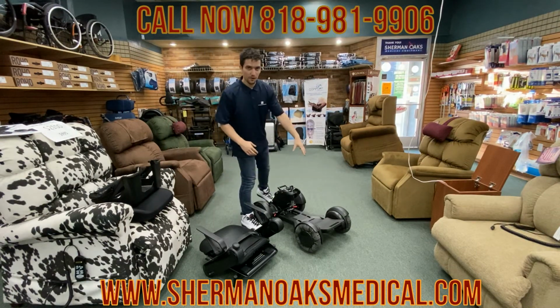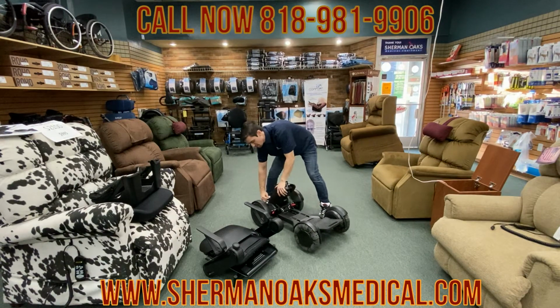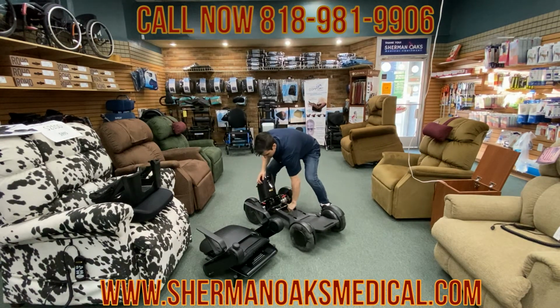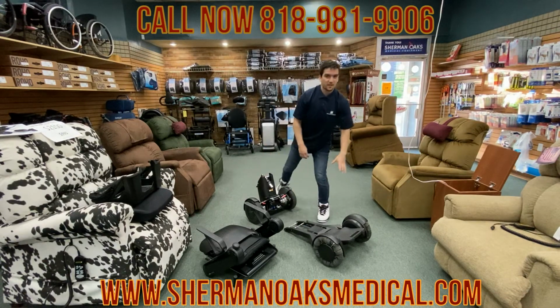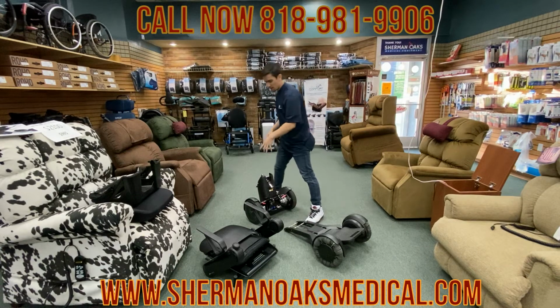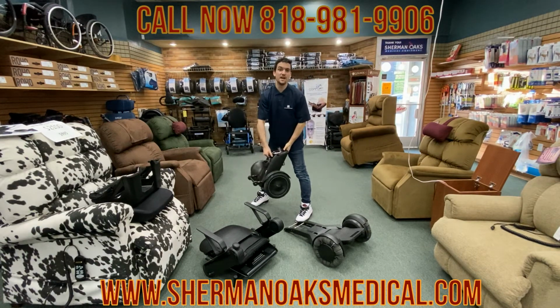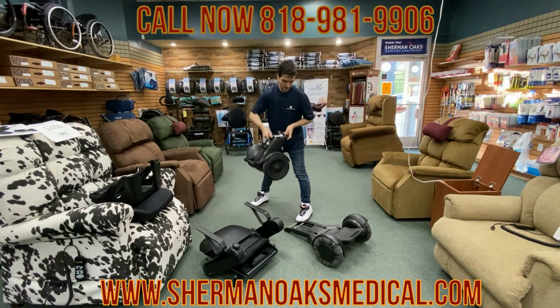And then next, it's our front and our rear. To do this, there's a lever right back here. I'm going to pull that lever, tilt this back, and our front piece is going to come right out. Our heaviest piece is going to be this rear section here. This is going to be the one that's close to about 40 pounds in weight, but yet it's still easily transportable.